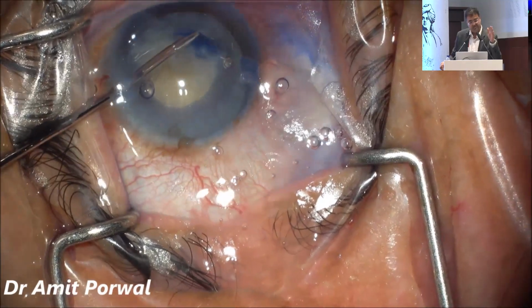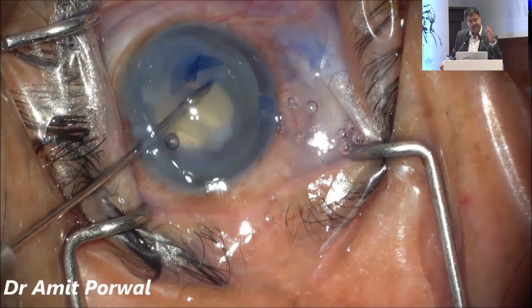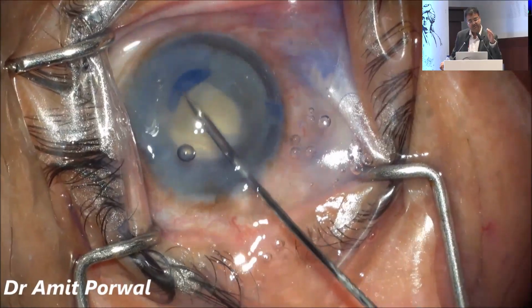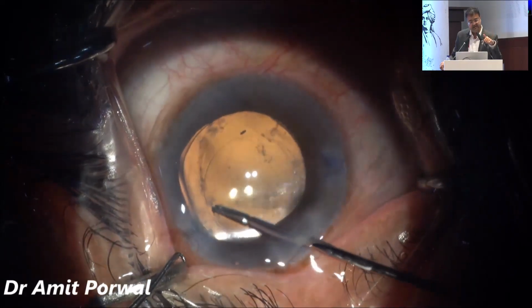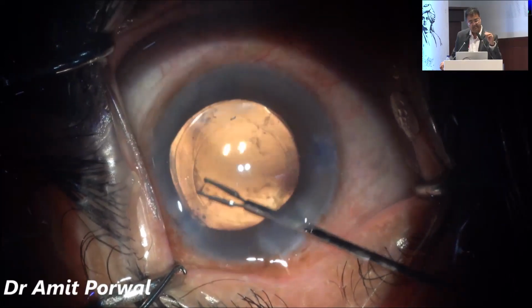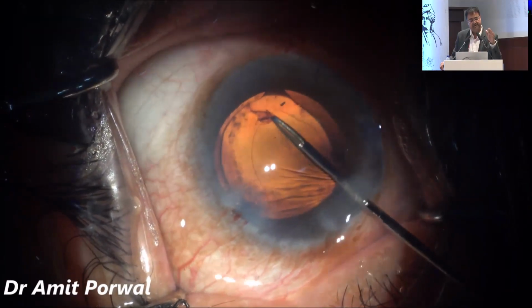So you can do a small rhexis or you can do a snail pattern rhexis, and whenever you feel that the visco is escaping, always put in cohesive. If your bag is collapsing, make sure that you inject the visco into the bag. This was a small rhexis, no problem. I implanted the IOL. Always give a tangential nick and then refashion the rhexis.